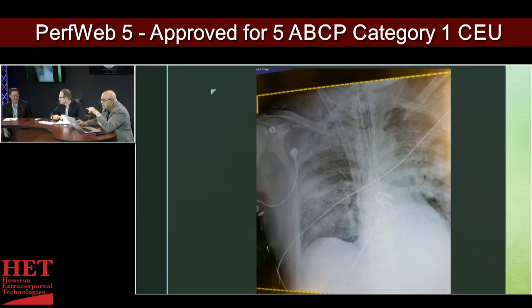Yeah, Patrick sent me this one and the next one, these two X-rays. So go ahead. But I want to let you know these pictures are actual cases. Yeah, this was the nidus for this whole topic, because I realized I can't read these very well. Started this whole thing, exactly. Yeah.